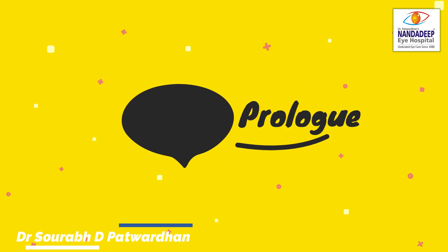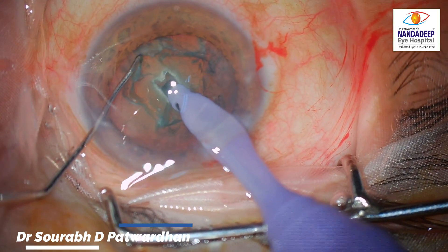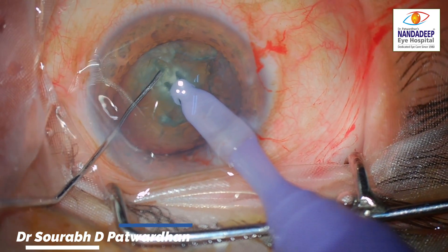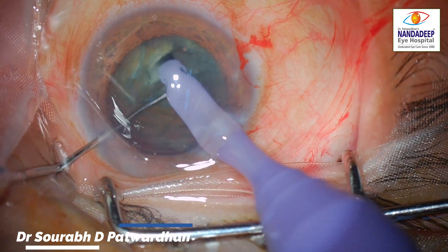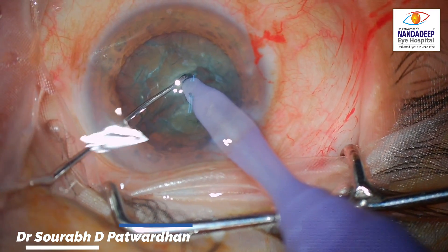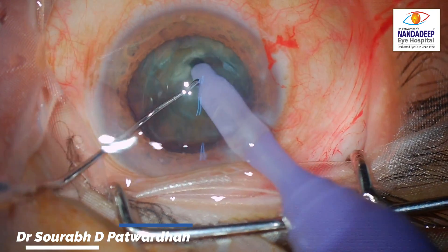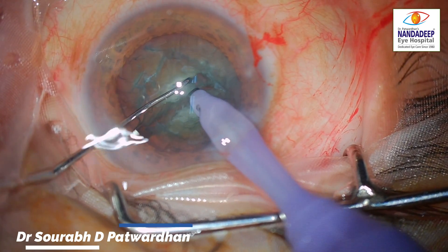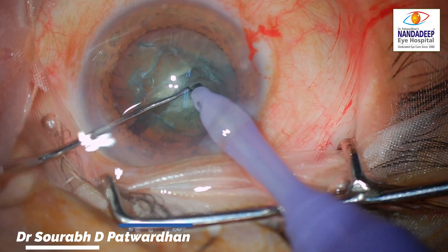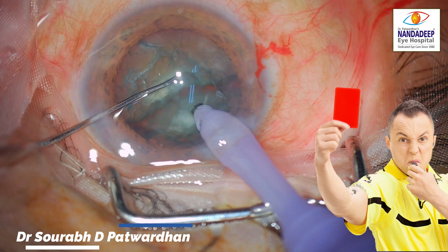You must have wondered how this happened — it was because of performing phaco in the unsafe zone. But this was the prologue. Now watch all the different steps where he went wrong. The tip is not buried and he is trying to chop, because he is fond of chopping and does not like the divide technique. You can see the nucleus rotates over the feco tip, which indicates that the buried tip is not effective.